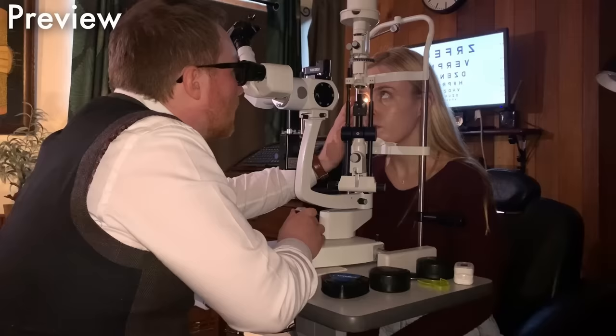And looking over to your left. And looking over to your right. Looking up very gently over your eyelid. And looking down.